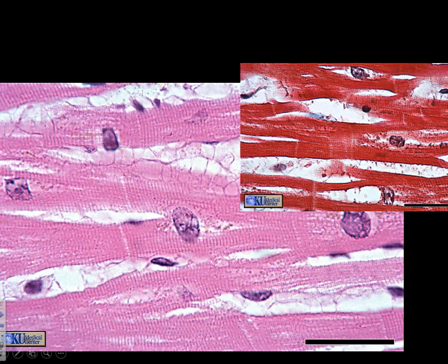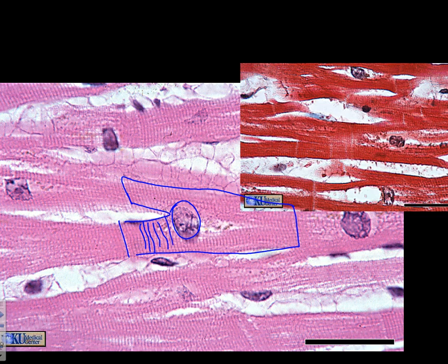Looking at the three types of muscle. All right, this first one got big nuclei. Okay, we've got striations, all these little stripes going here. We've got the shape of the muscle. Like that, kind of that branching structure on that particular one. So we got striations, which means it's either cardiac or skeletal.